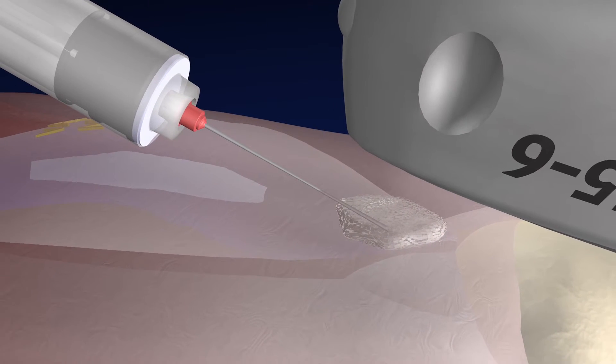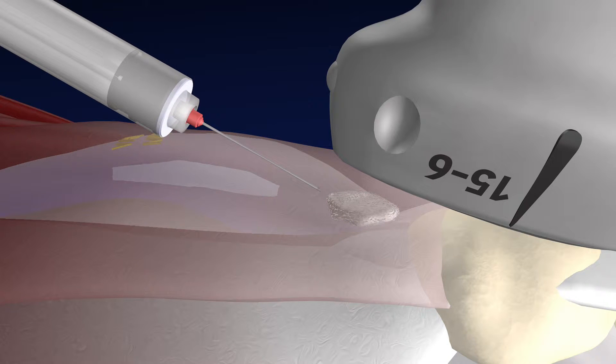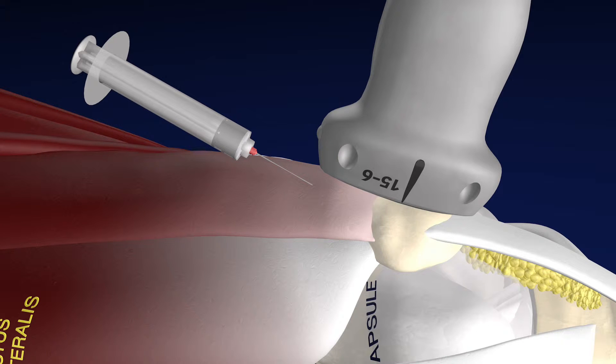You can see some of that calcium starting to get broken up, perhaps at a very small level. Here we're injecting the cortisone as the final part of the procedure. Here's our tendon — you can see it's somewhat red relative to the other tendons, consistent with some tendinosis and irritation.